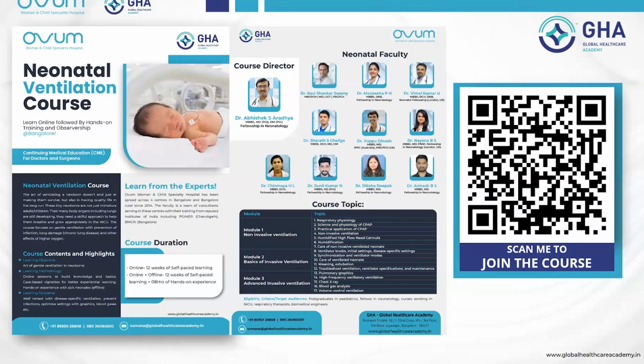They continue to be on CPAP or nasal IMV for long, so surfactant has not been given. I have seen many babies improving by giving surfactant if the baby has RDS. Whether 2nd or 3rd day, we have given surfactant and babies have shown dramatic improvement. Although the Western world says that after 24 hours it doesn't have much effect, always go for surfactant and CPAP rather than going for ventilation. Give a chance.